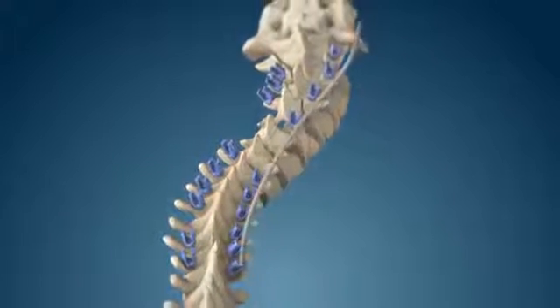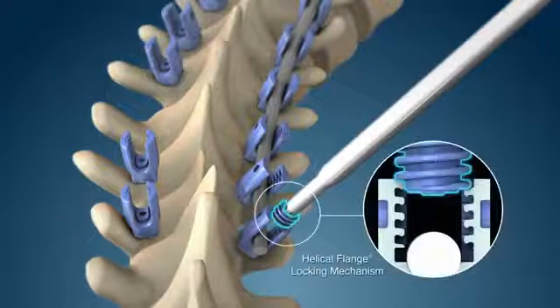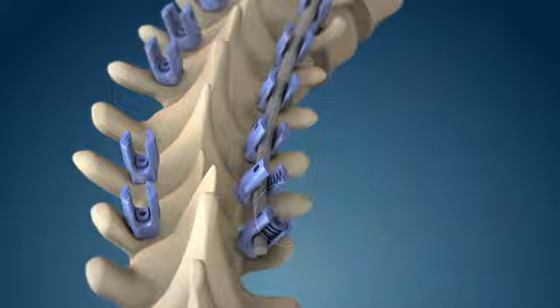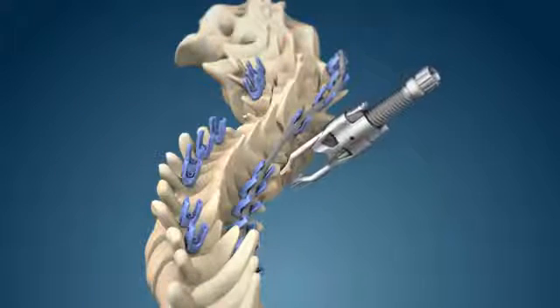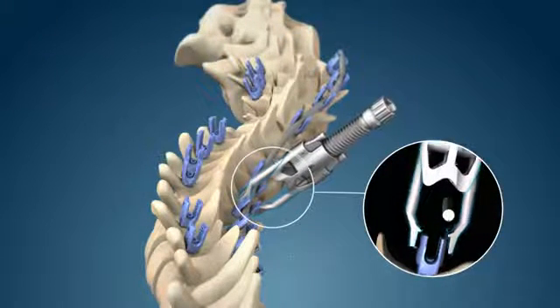The appropriate length rod is selected and contoured to match the desired sagittal profile. Derotation helical flange plugs engage the top screws. The threaded rocket reducers may be used to align the rod, progressing in a caudad direction.